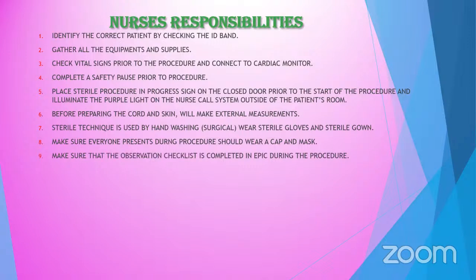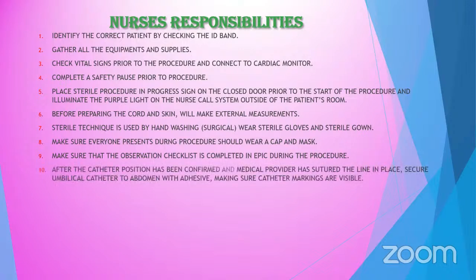Then make sure also that the observation checklist is completed during the procedure. We have checklists, and we should check that it is all complete before starting, during, and after also. And then after the catheter position has been confirmed and the medical healthcare provider has sutured the line in place, also secure the umbilical catheter to the abdomen with adhesive tape or an umbilical catheter holder. Make sure catheter markings are visible. For example, 12 cm should be visible, we can see that. Then 7 cm also we can see.